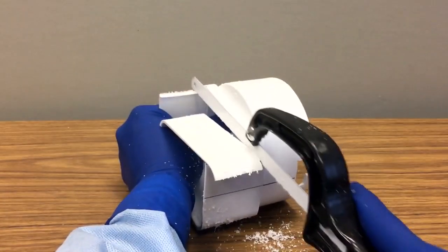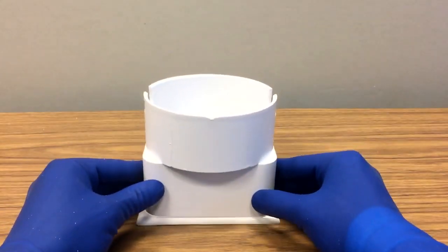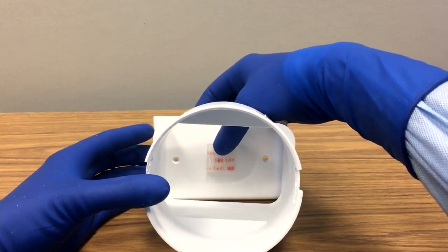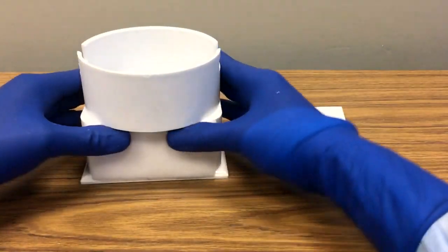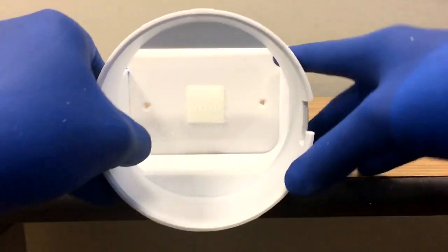To allow the use of ambient light, a 4 centimeter wide rectangle is cut out from the top and removed. The base is glued to the electrical plate, making sure it is flush with the bottom of the model. A square fastener is attached to the middle of the inside of the plate. Velcro is placed on the bottom of the model with a corresponding attachment on the table edge. The base is now complete.